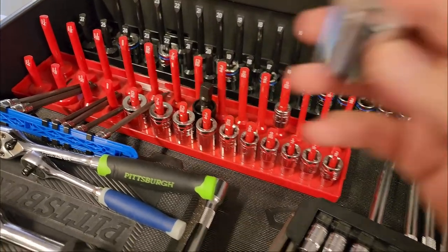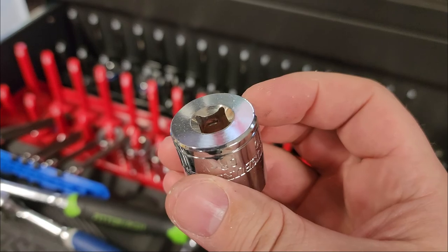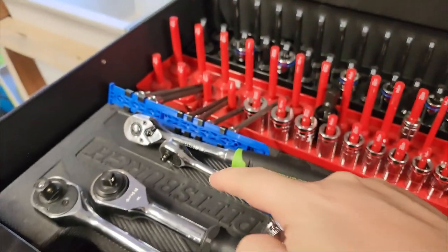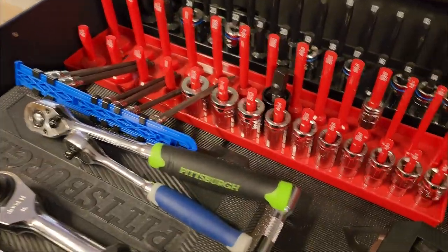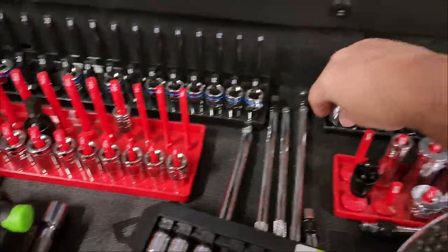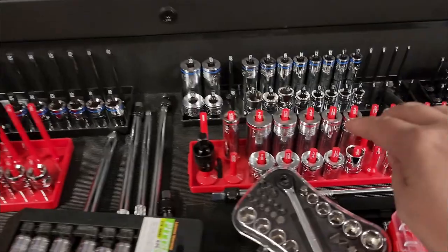On all sockets, down inside, there is a little notch cut out of all four sides. That notch is what is retained by the little ball on the ratchet head — that's the retention system at work. I'm very strict about putting these back in their proper place.